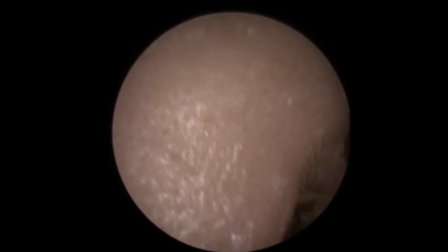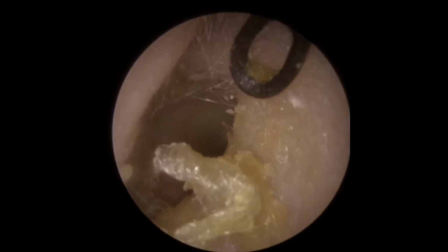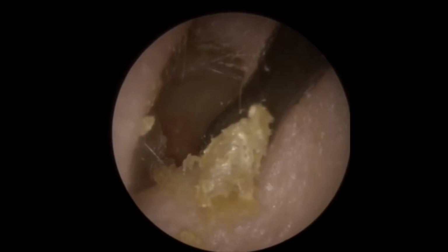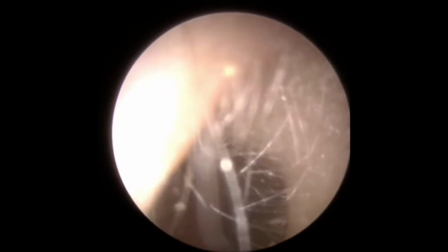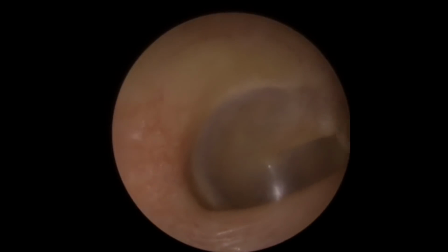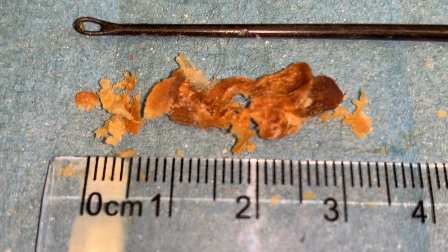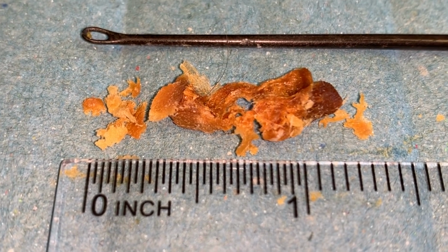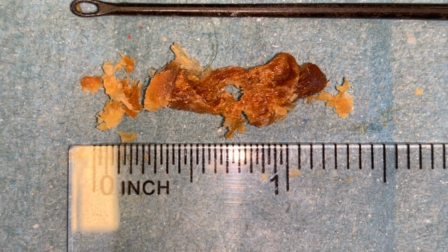There you go. And there's a little flap of dry skin here to the right side. So I'm just going to pull that down. Just trying to shear it off there at the entrance to the canal. There we go. And get a good look at that drum. There we are, looking nice and healthy in there. So you can see how long and stretched out this wax has become. This all came out of one ear. So you can see how thick that plug was and just how stretchy and sort of elastic almost that wax was.